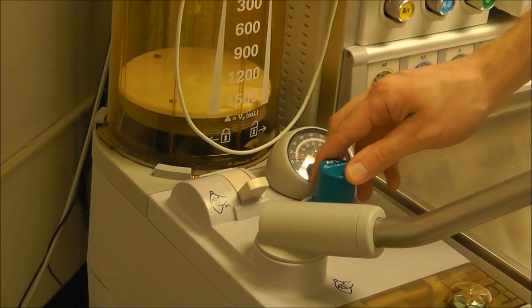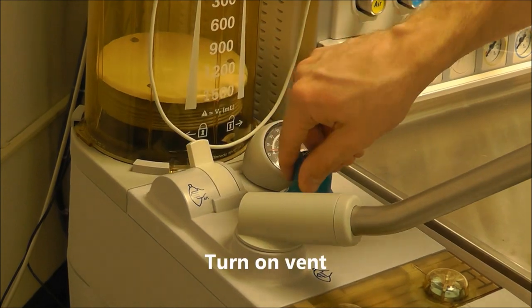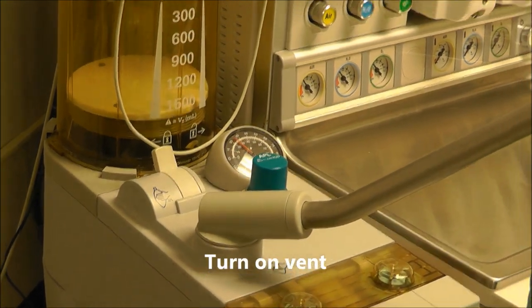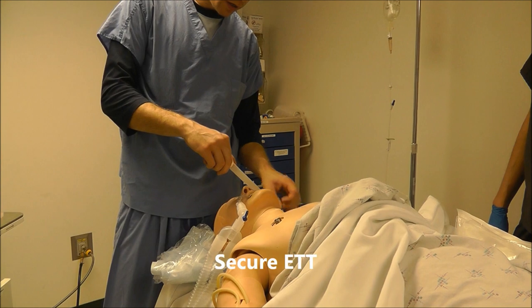After we've confirmed that breath sounds are bilateral, we'll go ahead and place the patient on the vent. Now we can go ahead and tape in our endotracheal tube.